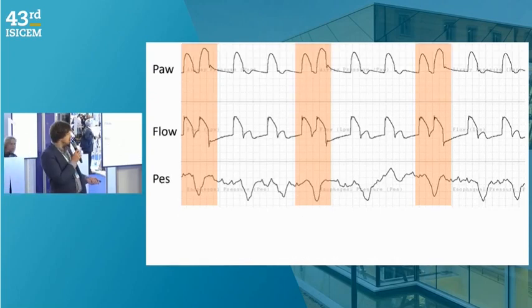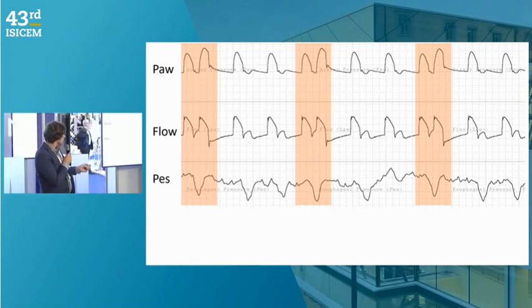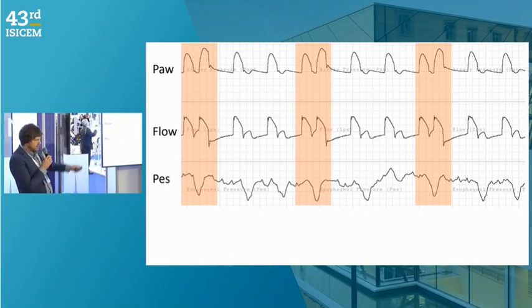If you don't believe me that this is a pattern, this is the same patient. We actually did have esophageal manometry in. And so now you can see that that second breath is clearly starting after the machine cycle. And it's clearly a forceful patient effort. You see the negative deflection in esophageal pressure there.